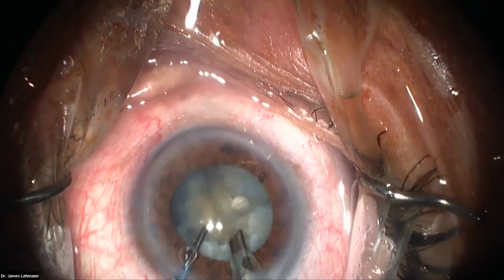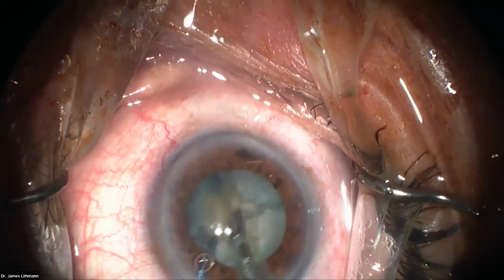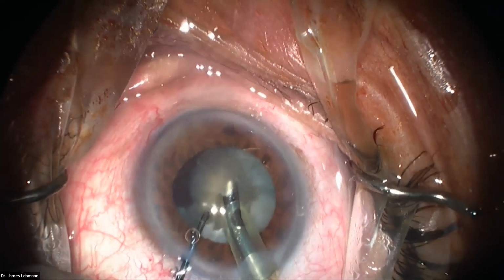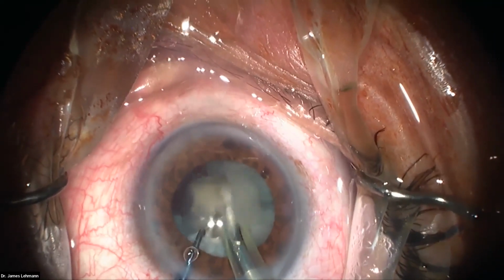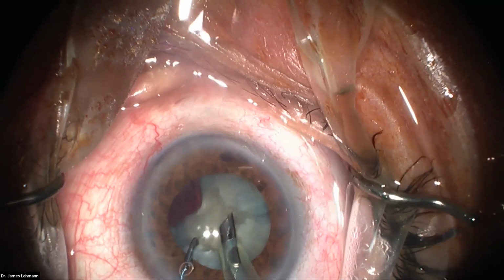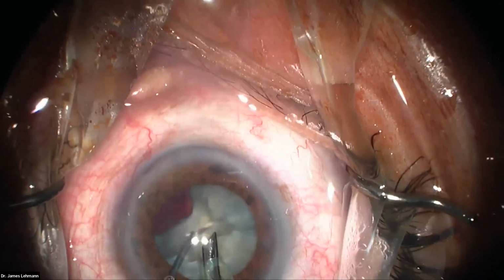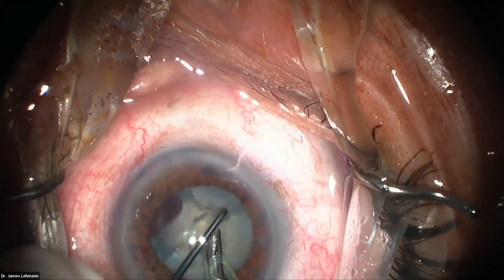And then I'm just going to push on the pedal, kind of like 80%. Get it up a little bit. And so see, I'm right in the plane of the iris, maybe slightly superior to it. And I'm not really moving the phaco tip. If you have the right settings on your machine, the little guy will just kind of dance on the tip there. So now we have this piece that I can get.